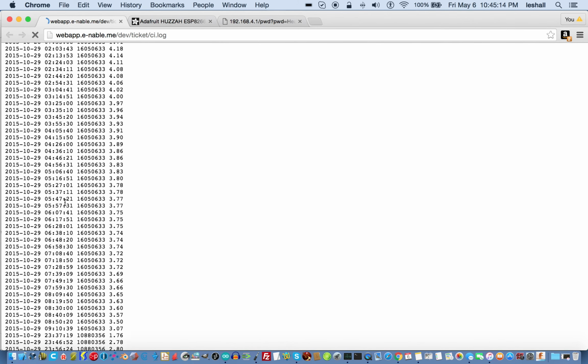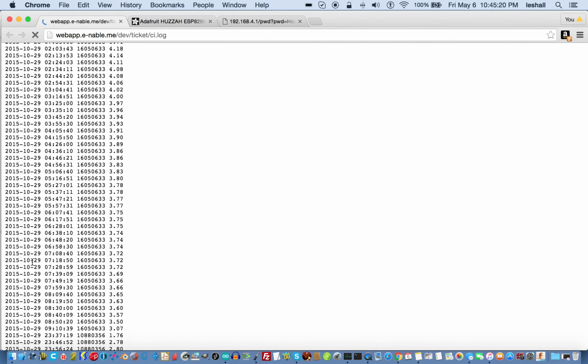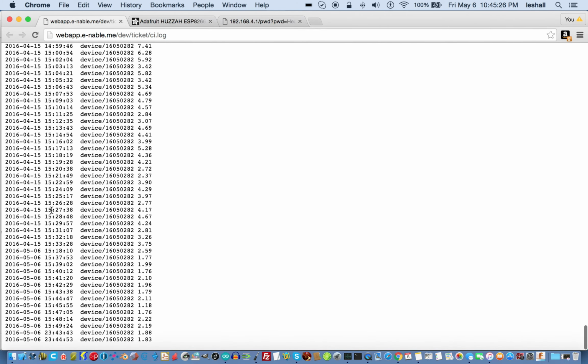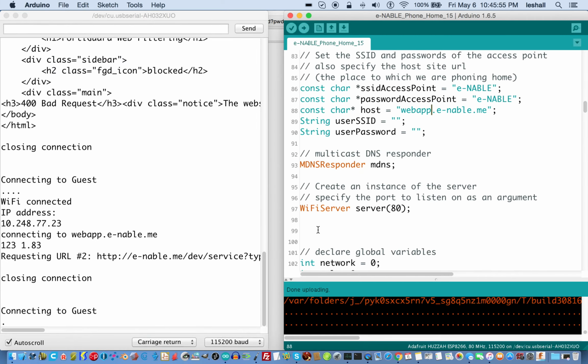Scrolling down to the bottom, we see some kind of network delay. Let's stop it and start it again. Go to the bottom. Here we are today, 5/06/2016 at 11:44 here, or 10:44. No, that says 11:44 because that's where the server is. But we are here in Central Time, and it says 10:45 for us. So this device, I think I have it going. Let's check the Arduino code.